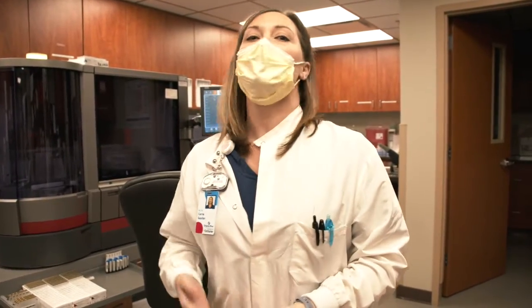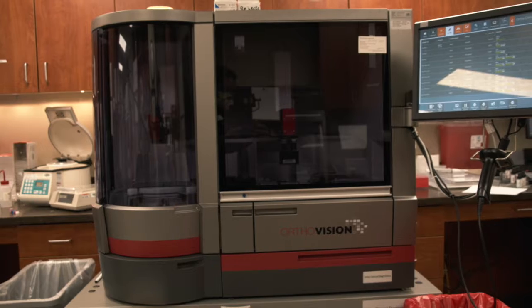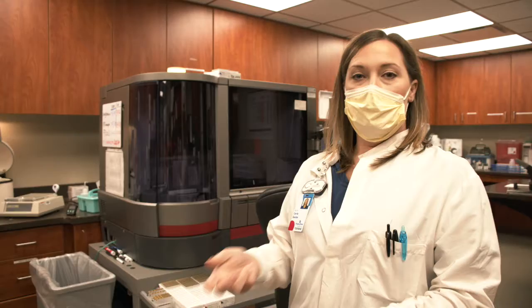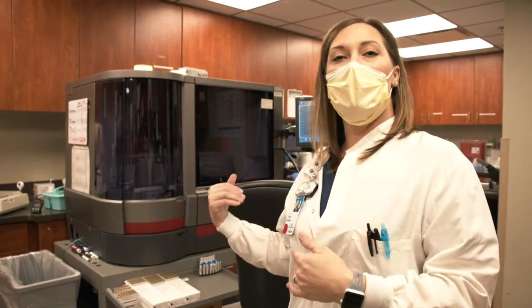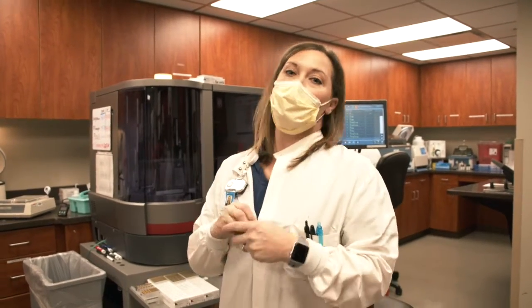We will determine if that patient has any antibodies present and exactly what type of blood they need, and we'll make sure that blood's free of any antigens that patient may have. That blood's then compatible. It's checked. This is an instrument that can do our blood matching here, and then it can also be done manually. Of course, if needed, if we're in a hurry, sometimes we'll do it manually. We may do it on the machine in batches, depending on the urgency of that blood product. We'll ensure it's compatible. There'll be no problem once that patient receives that unit of blood.